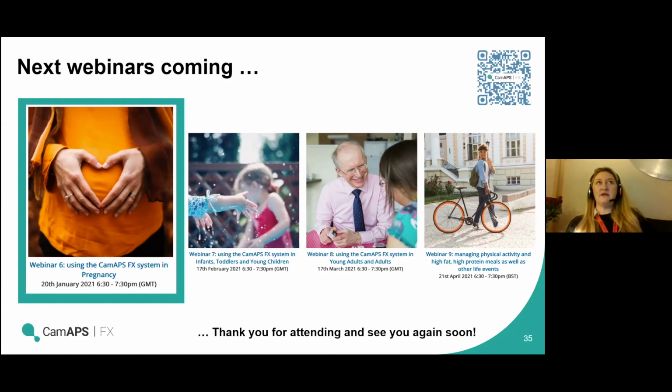In the situation that you describe, though, I would be starting to think, why is the glucose rising above a high level like 15 when the system's ramped up and it's not really having any impact, and I've put Boost on top? Have I got a set failure? Is there an issue with the site? What's going on there? That would be my thinking. Do I need to check ketones?